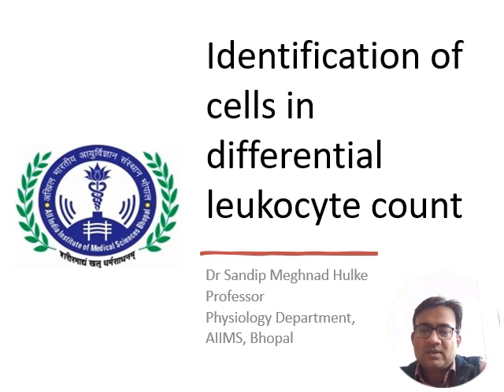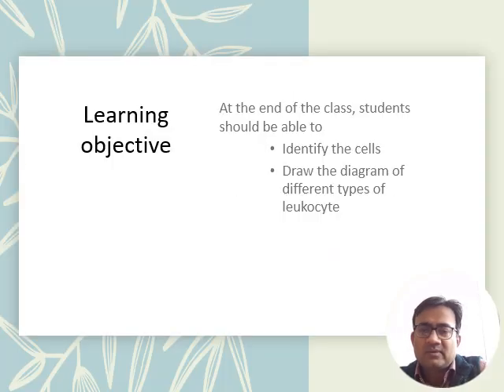Hello friends, today we are going to discuss how to identify the cell in DLC practical. So we will be identifying the cells and we will also be able to draw the diagrams of various leukocytes.